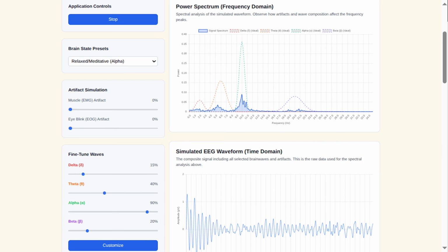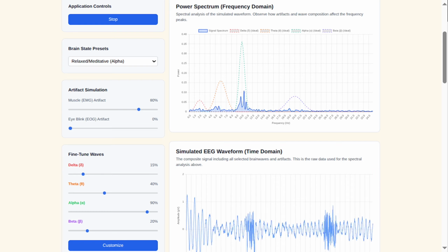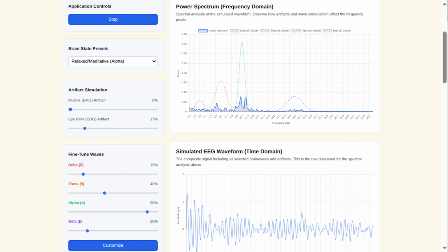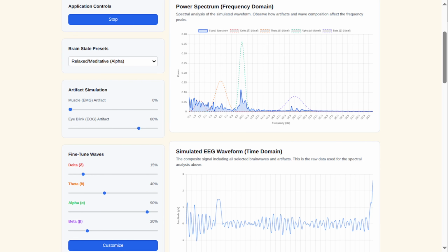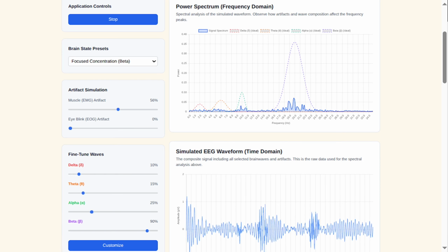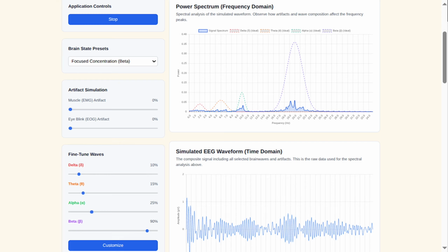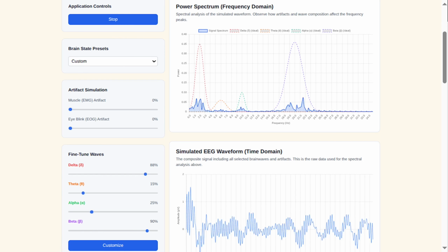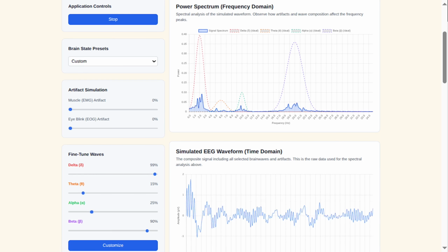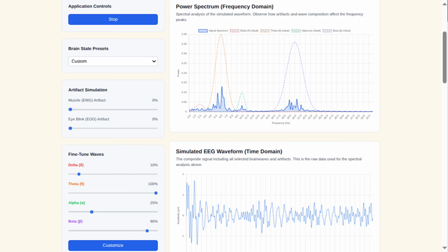Where's that electrical signal coming from? The electrical signals measured by EEG come from the synchronized activity of neurons in the brain, especially from the cerebral cortex near the scalp. Why is the cerebral cortex special? Isn't the neural activity everywhere in the brain? Neural activity happens everywhere in the brain, but the cerebral cortex is closest to the EEG electrodes, making its electrical signals easier to measure on the surface.